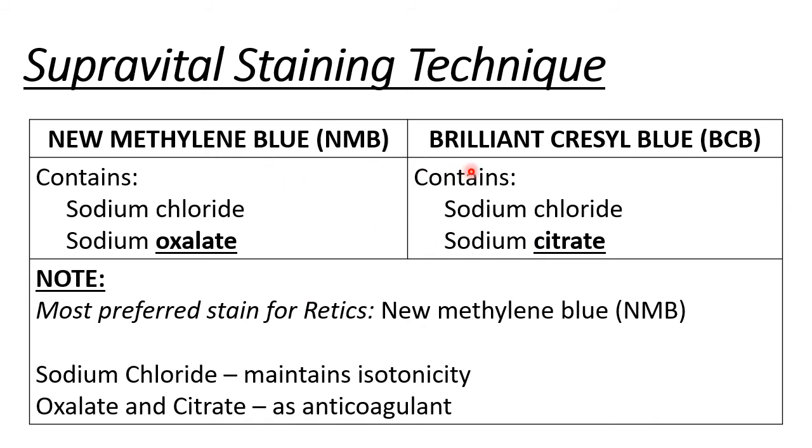And which is preferred over the other? NMB is the most preferred out of the two staining techniques, because it is more readily available for the staining of reticulocytes.